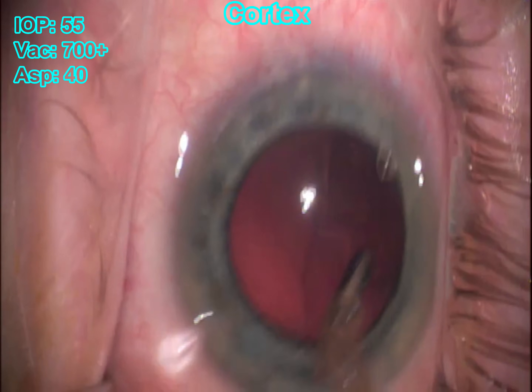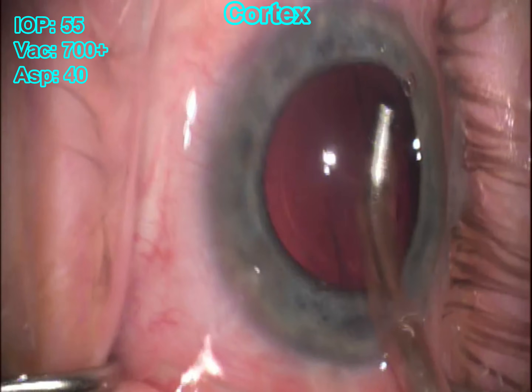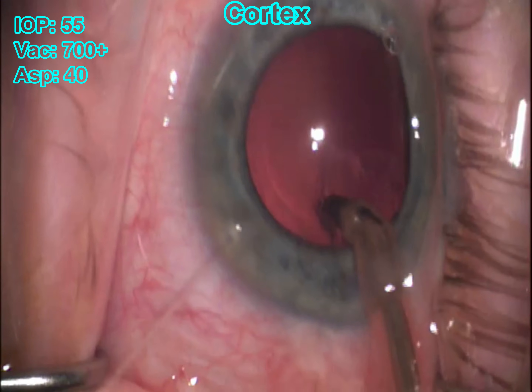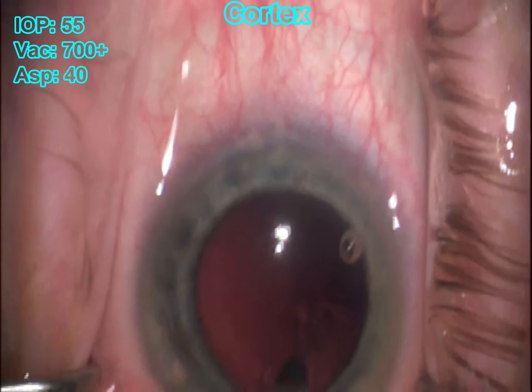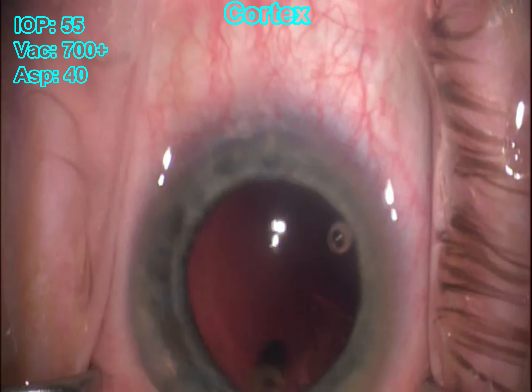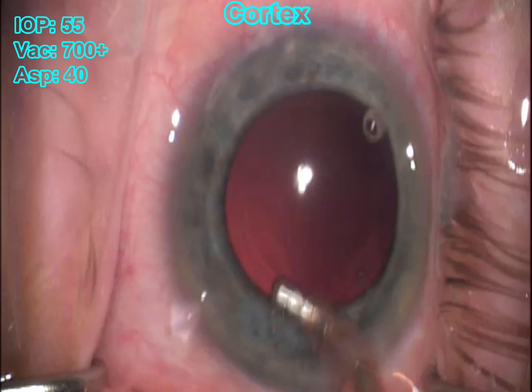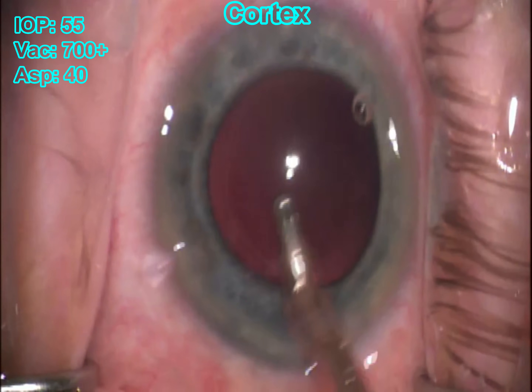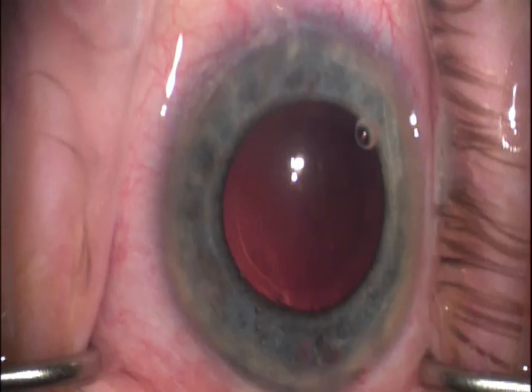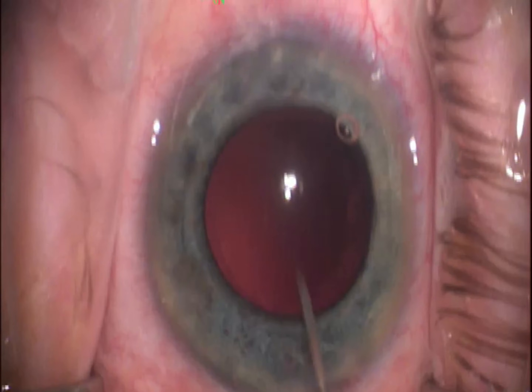Here you can see we only really have that subincisional area left over, a little bit laterally. We're cleaning it up to make sure everything looks good. That subincisional area is still sitting there — you just take your time. If it's really sticky, don't rush it. The last thing you want to do is get to this part of the case and then tear the posterior capsule. I'm just chasing that last little bit of cortex — and there it is. I preferably don't polish anything. I think polishing the posterior capsule just puts you at risk when it's not needed — that's what our YAG lasers are for. If I see a PCO, it's much easier and more controlled just to YAG that.